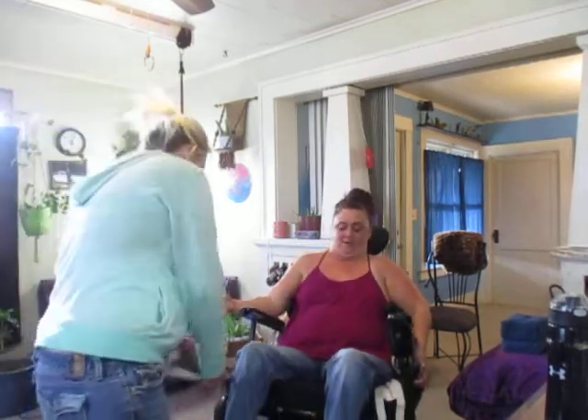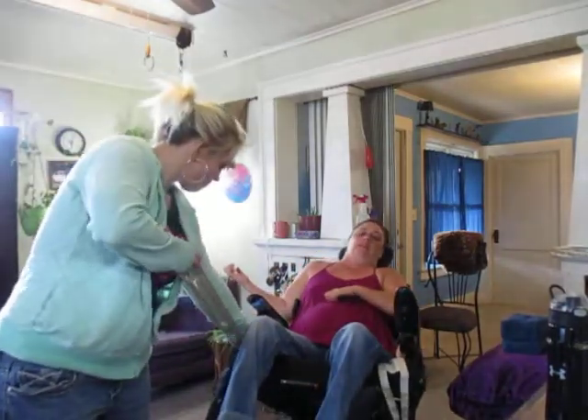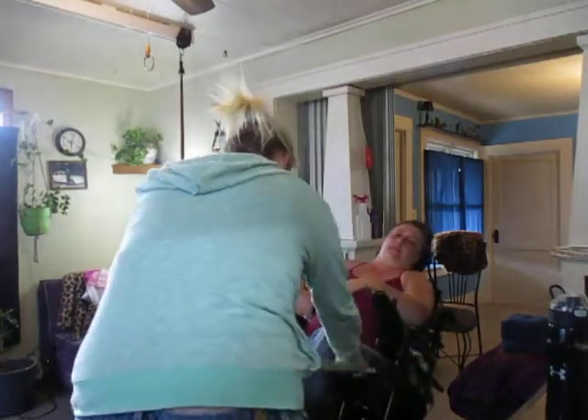Because if the sling isn't under my butt bones, when it goes to lift me, it doesn't lift me evenly. And it ends up spreading my legs from my back, and it ends up hurting really bad. So I'm going to tilt back. Once they got it under my butt bones, I will have them pull it straight forward, like two inches, because then it ends up finishing itself. And the same thing with this side.